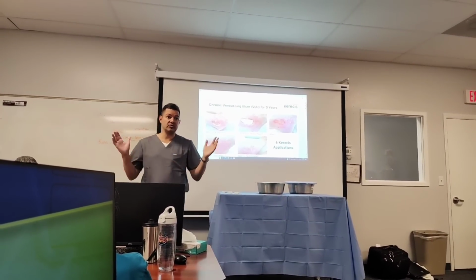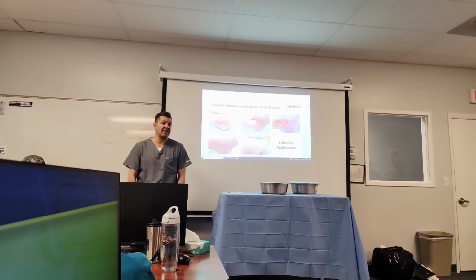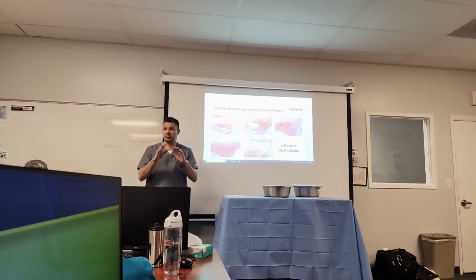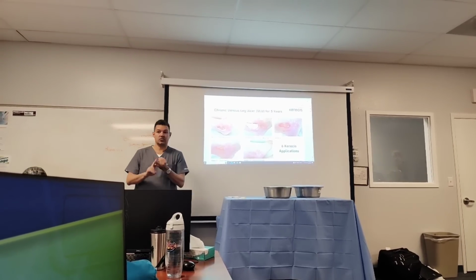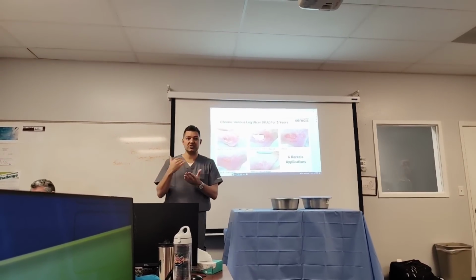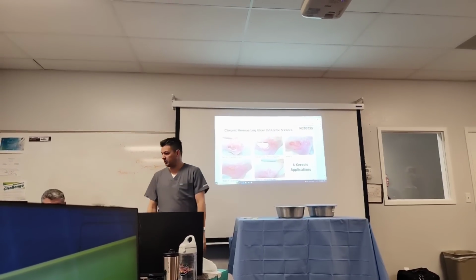I mean, we're healing wounds that haven't been able to heal in 14 months. We're doing them in a month and a half, 2 months. Now, I'm going to put an asterisk next to this. Let's also be clear that if they're diabetic or smokers, those are areas that can hinder the healing that comes with it. Next slide, please.